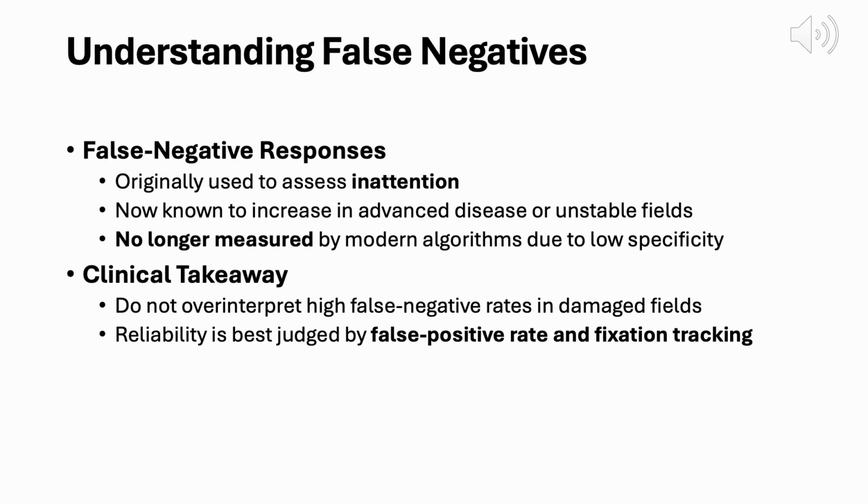Now let's talk about false negatives and why they're not always as informative as we might think. False negative responses were originally thought to reflect patient inattention. If a patient missed a bright stimulus, it meant they weren't paying attention.